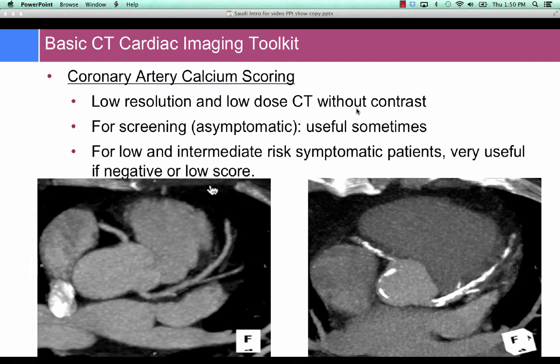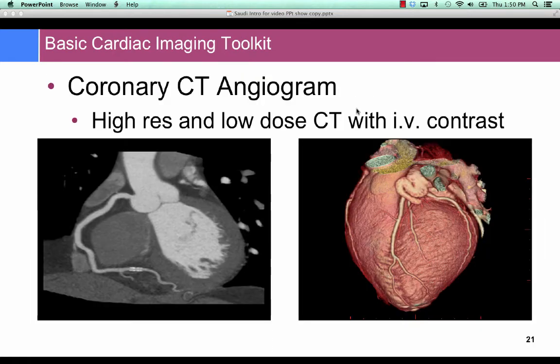And also for patients with uncertain symptoms, with the lingering debate about whether symptoms may or may not be due to atherosclerosis, the negative predictive value and the prognostic value of a negative or a low calcium score is hugely valuable in directing patients away from a more aggressive workup and perhaps an angiogram to make sure that patients are normal. CTA really does not have a clinically proven role in a screening position, but calcium scoring does. CTA, on the other hand, is a totally different animal.